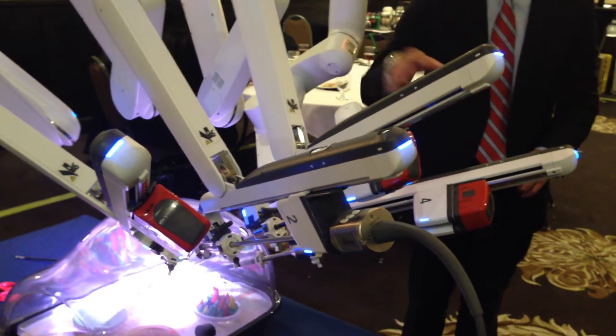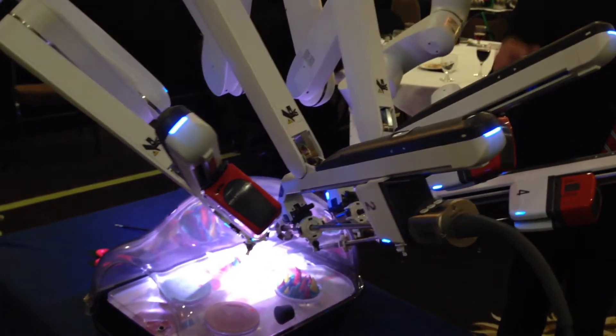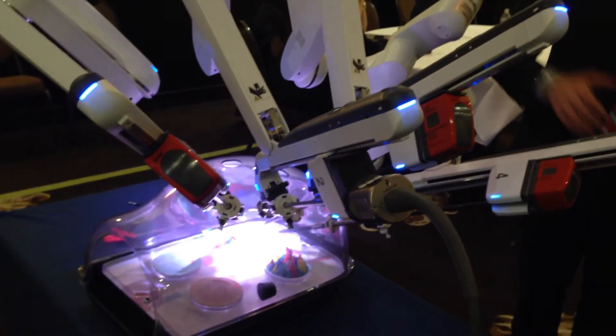You'll be able to go to multiple quadrants within the patient with a single dock. The ports are much closer together, so it's a more forgiving port placement based on the construction of the system.